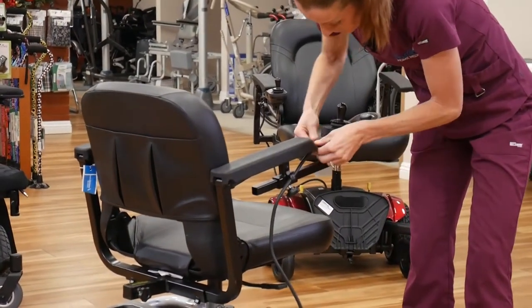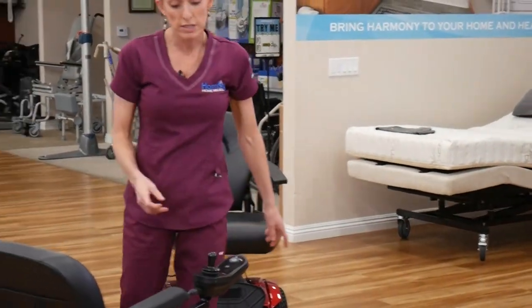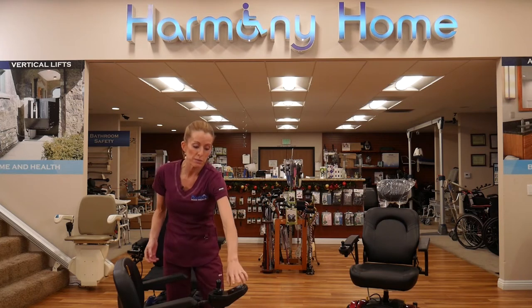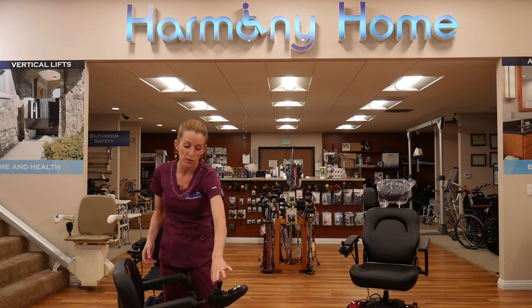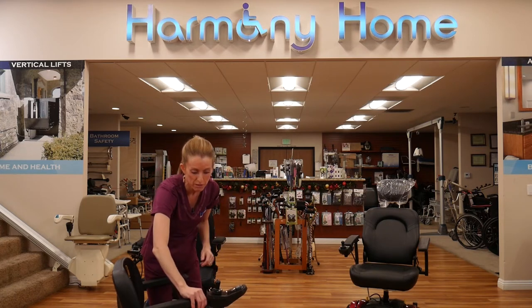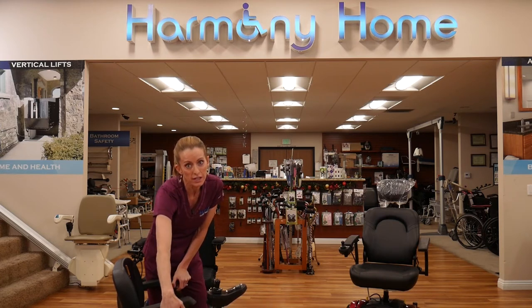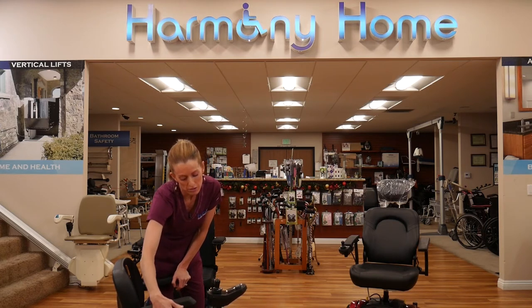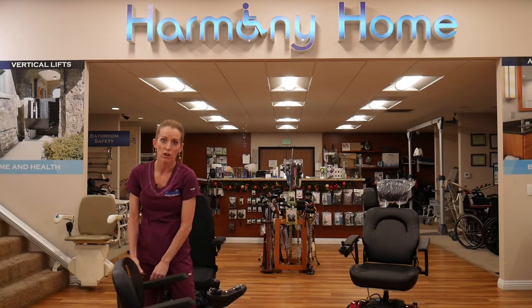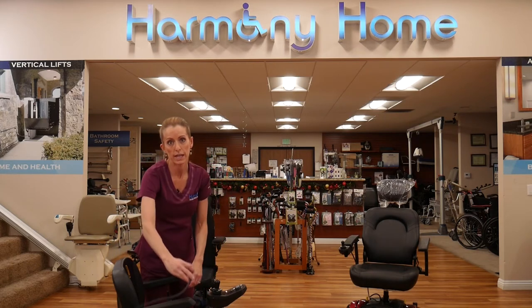A little tip: if you're somewhere and going to leave your power chair outside, power chairs don't have keys. If you're concerned about someone turning it on and driving away, you can undo that pigtail connector and tuck it under the chair. Someone who's not a chair user or familiar with power chairs won't figure that out, so it provides a little peace of mind to unplug it when you go inside.